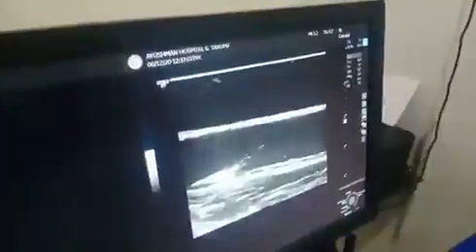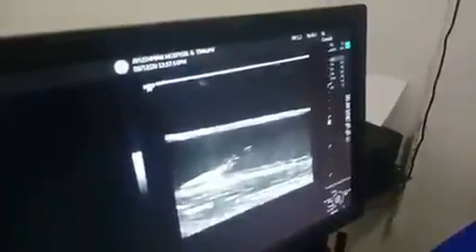So, you have to focus a vein of sufficient size and length. This is our intended vein and then you have to stabilize your hand over the probe and keep in focus both the vein and the needle.